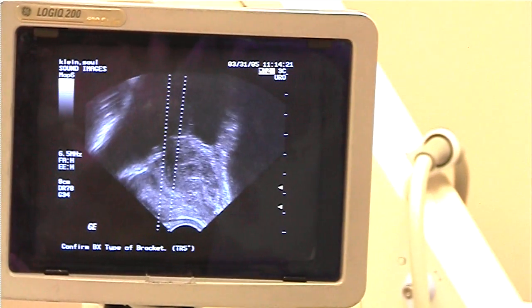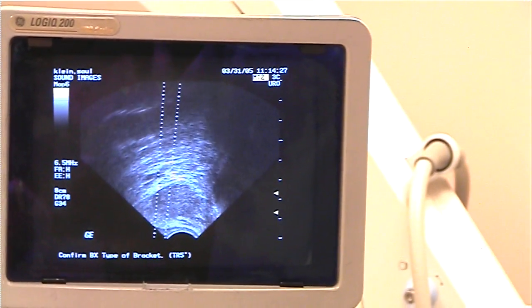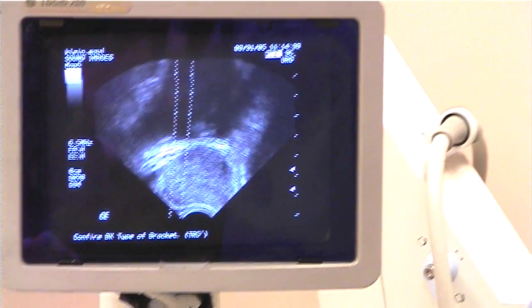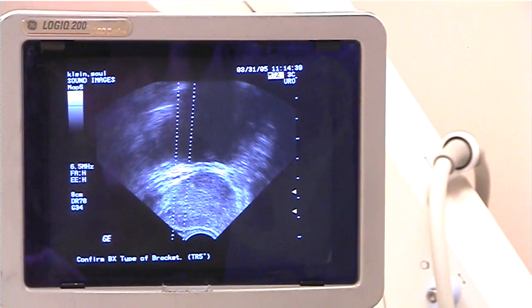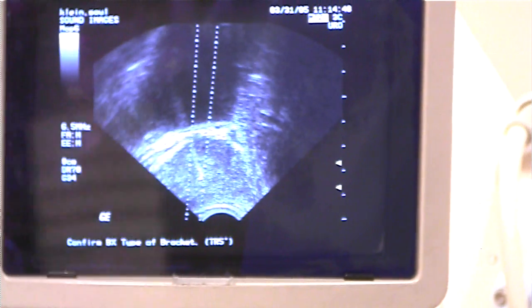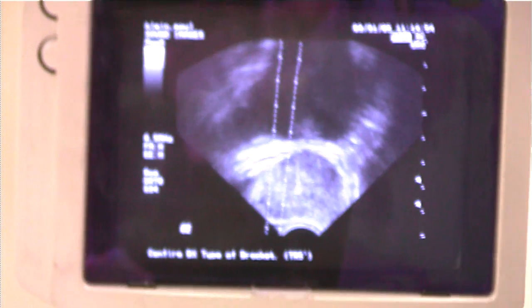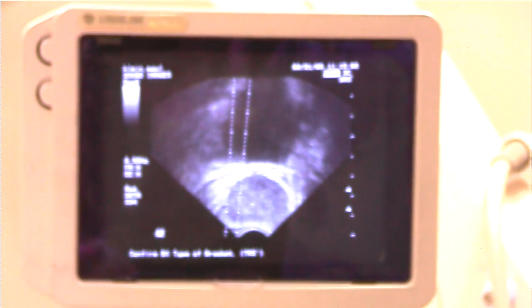We always implant four markers for our own particular IGRT system. Four markers gives it an extra level of precision, and then the DRR x-ray fusion. Let's go to mid gland this time — we'll go left to mid gland. And then let's just come to the left base. So we did the right base before — correct — and then we did the left base.